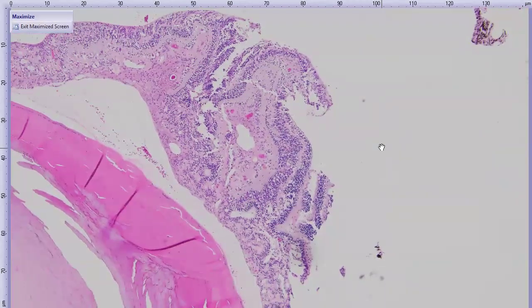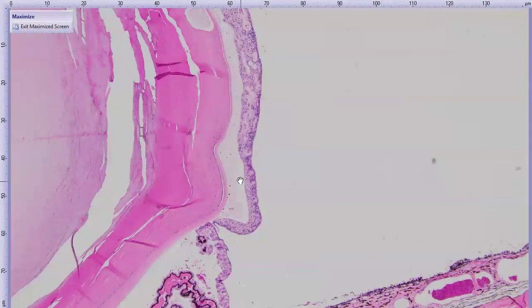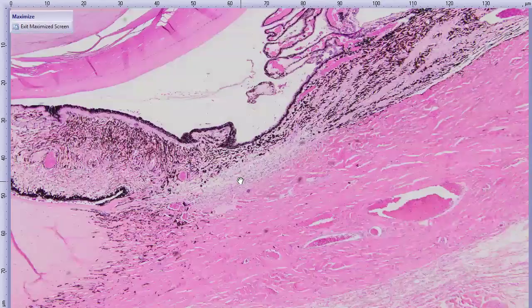It is diffusely detached, and you can actually start to pick up a little bit of circular rosette-kind of things, which is not uncommon, i.e., it is common in congenitally detached retinas and congenitally abnormal retinas, so a touch of retinal dysplasia as well.